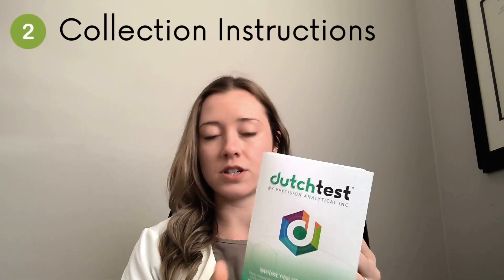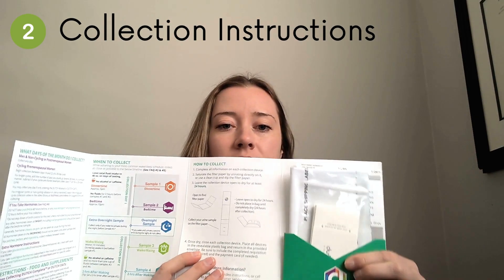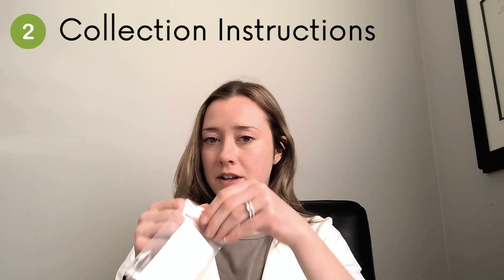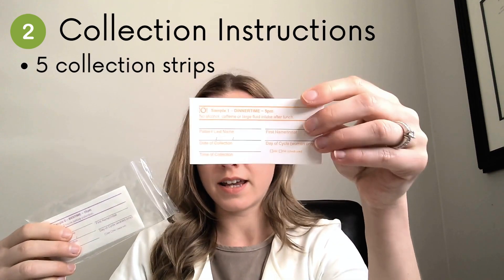The other part of this test is the collection instructions. If you open it up, it has everything that you need to know. On this side here is a folder with a few different things. Inside you'll find a plastic bag with all the collection devices — there should be five, and that's what they look like here.